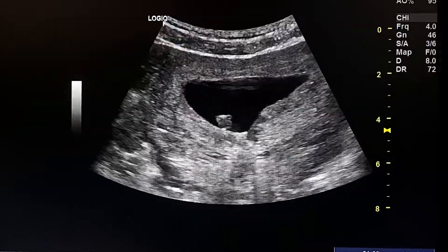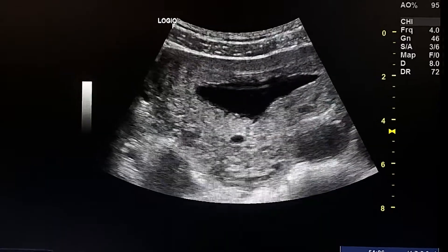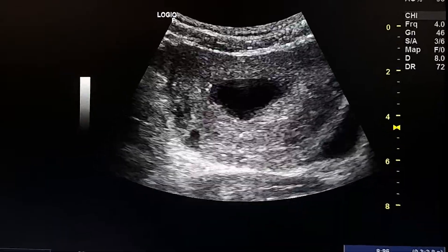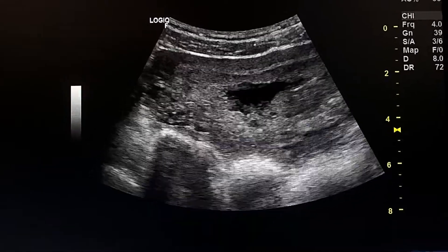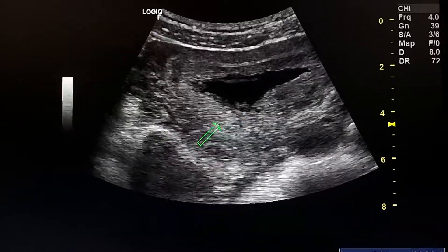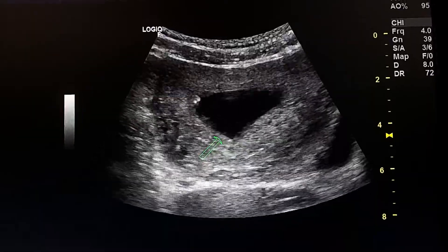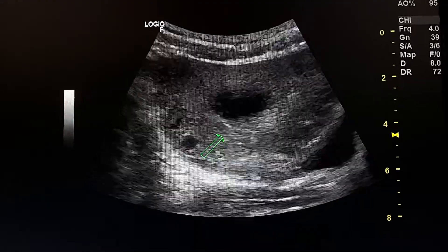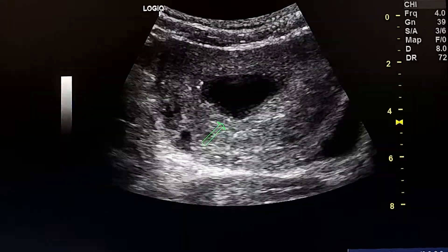This is an ultrasound exam of early pregnancy failure. We see here a gestational sac with a fetal pole. The fetal pole is hypoechoic in the dependent portion of the gestational sac, with no cardiac activity.